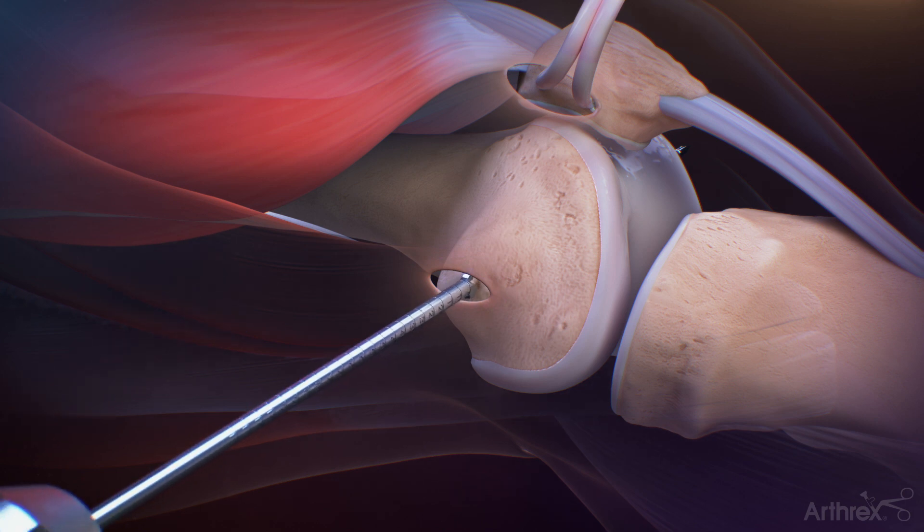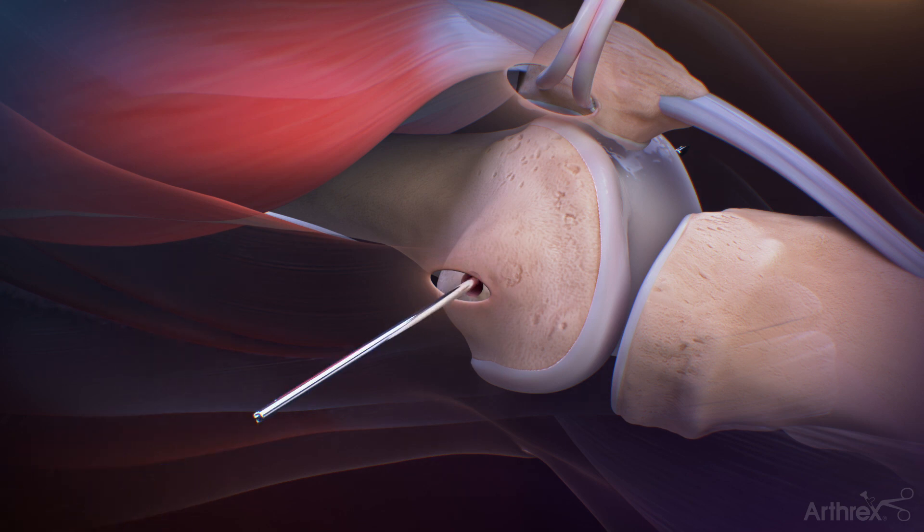The 7 mm low profile reamer is then used to create a socket extending to the far cortex. The 2.4 mm spade tip guide pin is maintained in the femur as it will be used to pass the graft sutures into the femur.